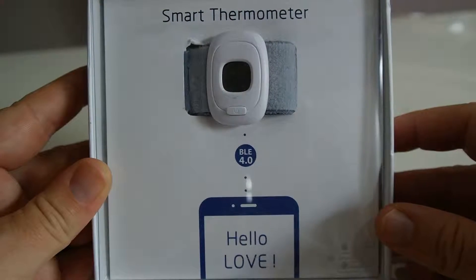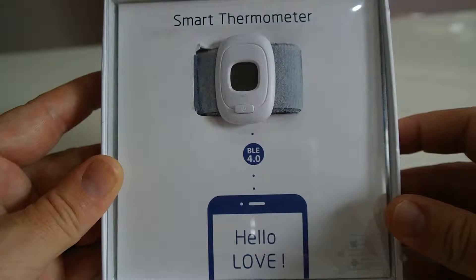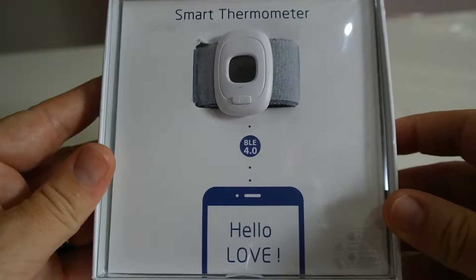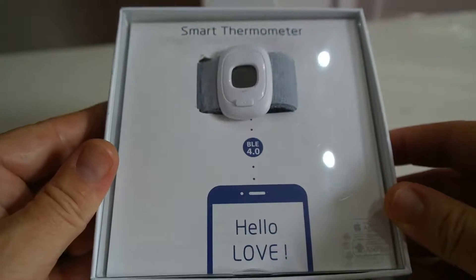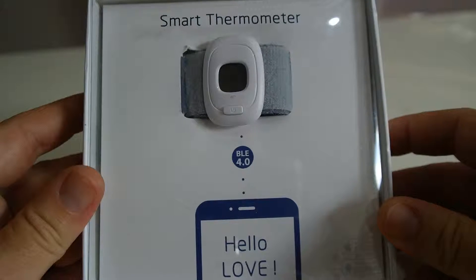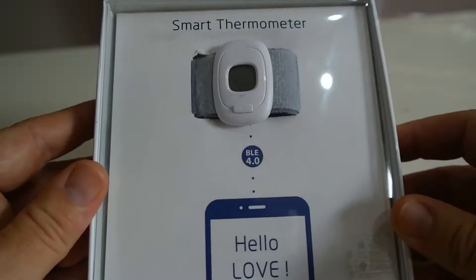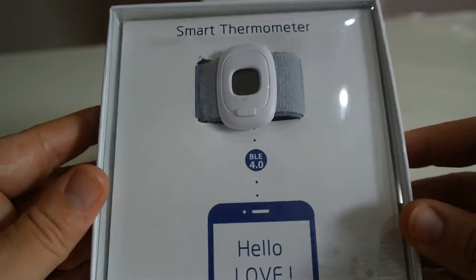Good morning, hi everybody, this is WayNotYet from WowWowWow. This morning we're doing the Smart Mom Bluetooth-enabled thermometer that you can use to view your baby or infant's temperature via your phone, or you can see it on the digital screen display. So I'm going to open it up for you.